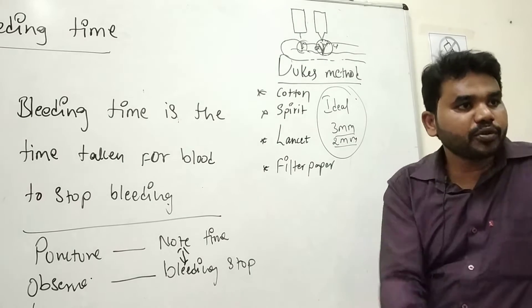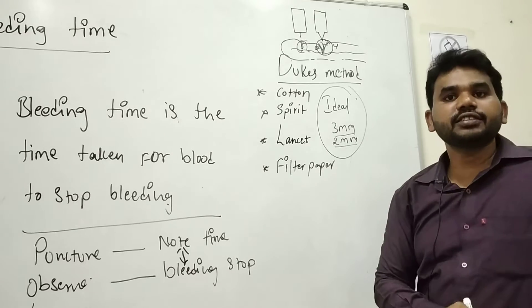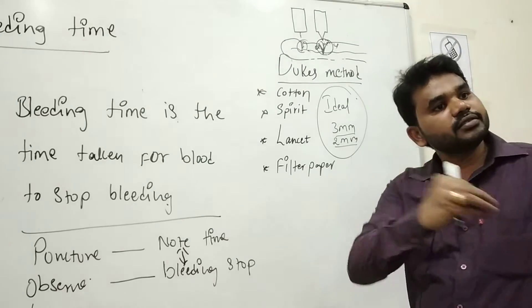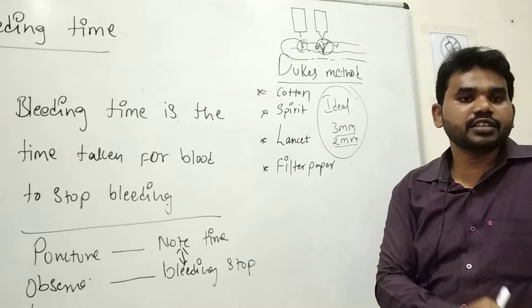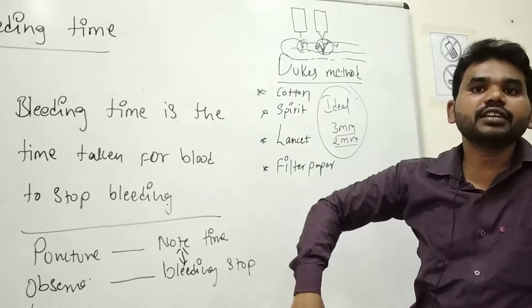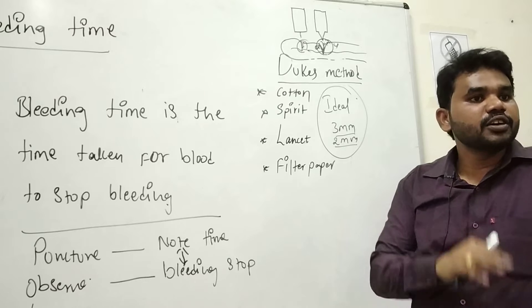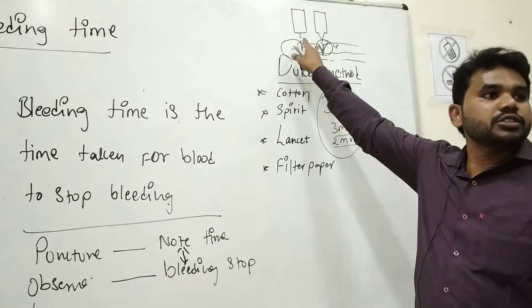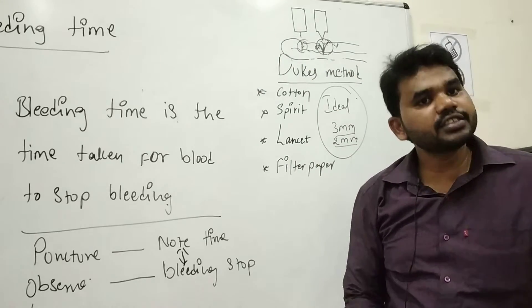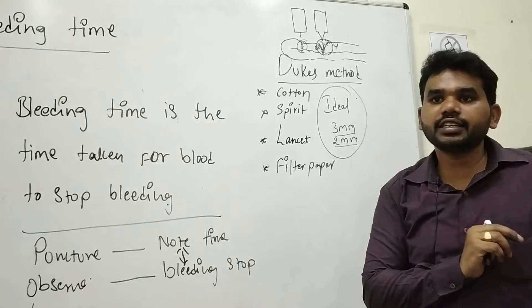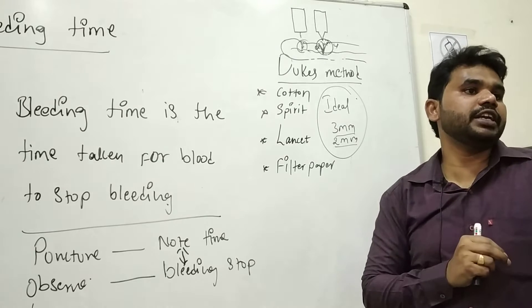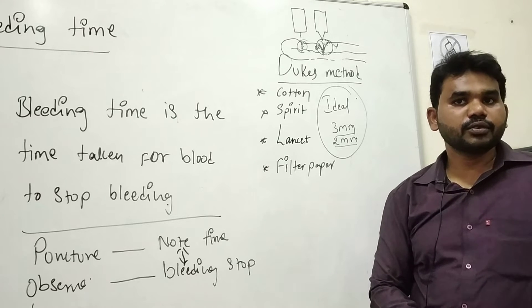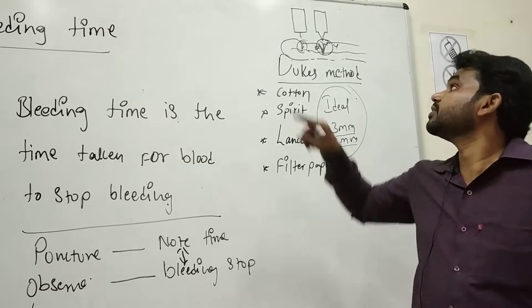So always you have to make an ideal puncture. If you perform the bleeding time using this plastic lancet, the blood will not come outside and you will report it as normal — bleeding time less than 30 seconds. If a doctor has to do an operation and the technician has given a report of less than 30 seconds, the doctor will take the person to surgery. When he cuts for the operation the blood will not stop, because the patient has a bleeding disorder and you have not done the test properly. Whose mistake is this?